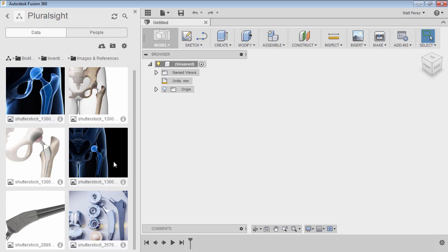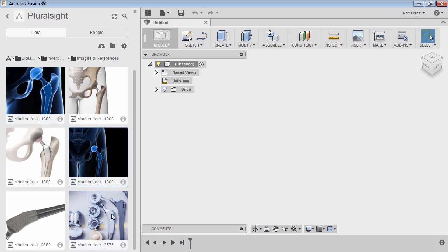We're going to be looking at this image right here, which has an x-ray image of the ball and socket and a different type of implant, but very similar in what we're doing in nature. And then the second image we're going to be looking at is this one here, and this is going to have more of the shape that we want.